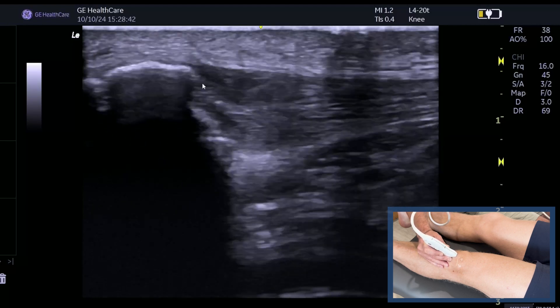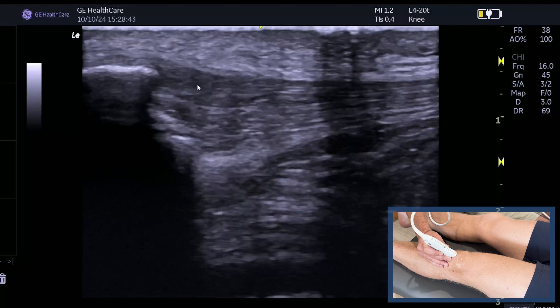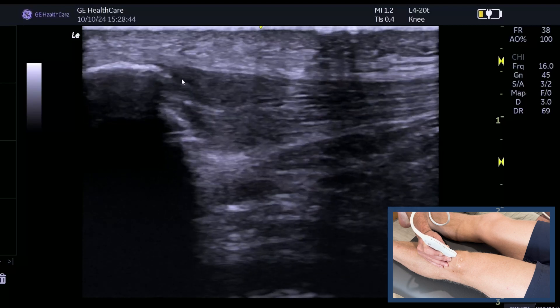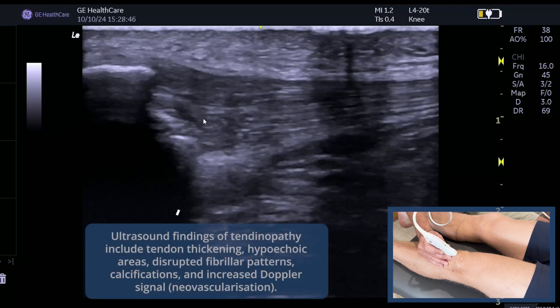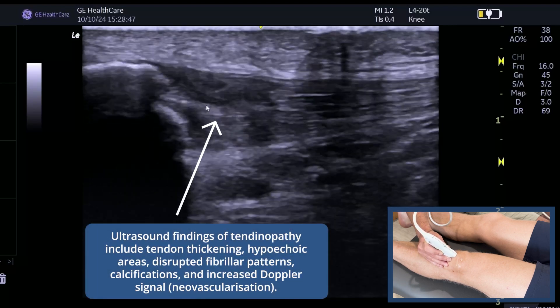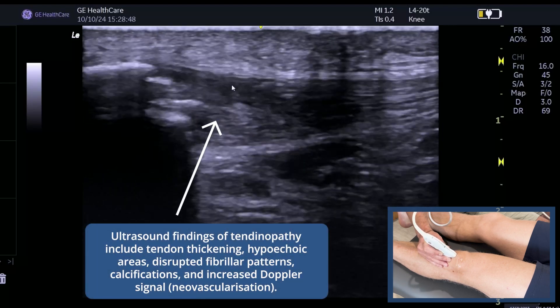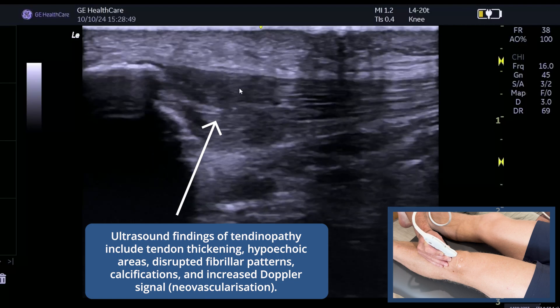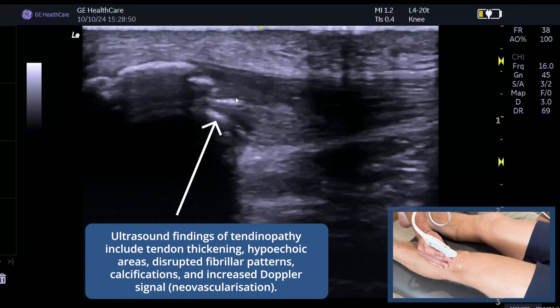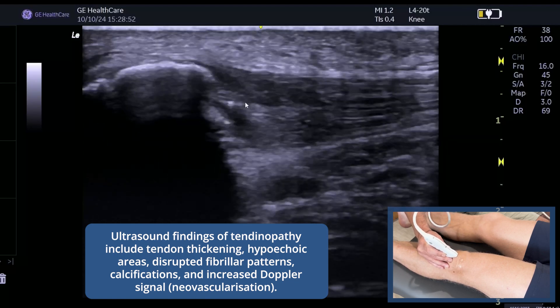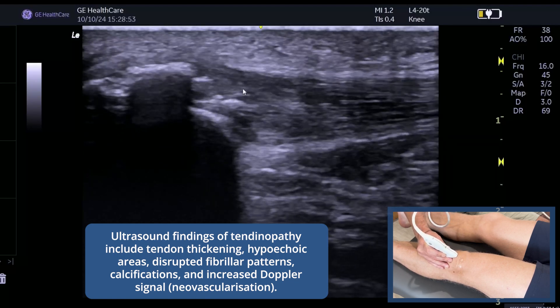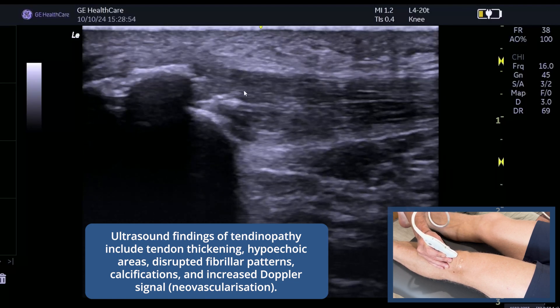And as we come more distally, you can see the heterogeneous appearance. You can see there's some hyperechoic region in this area. This is very much in keeping with what you would consider a chronic patellar tendinopathy.